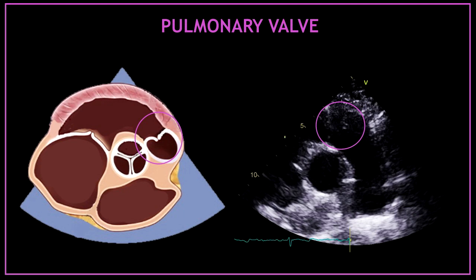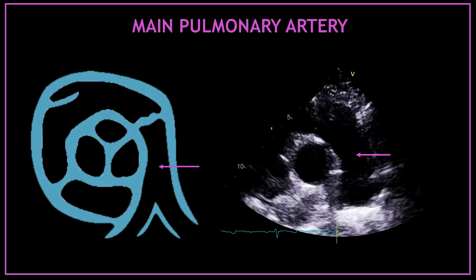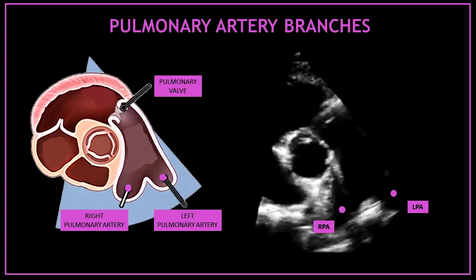The first valve you can see at the top from right to left is the pulmonary valve. Under the pulmonary valve, that vertical and narrow echo-free space corresponds to the main pulmonary artery. At the bottom, emerging from the main pulmonary artery, you can visualize the pulmonary artery branches — on the left you have the right pulmonary artery and on the right you have the left pulmonary artery.